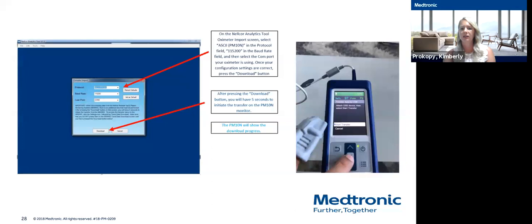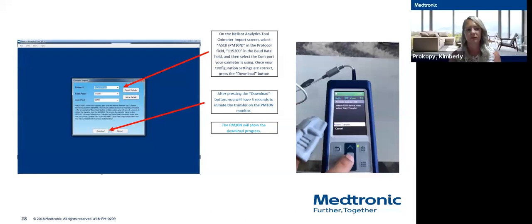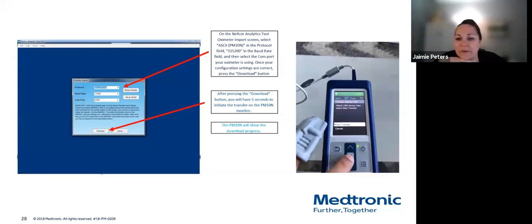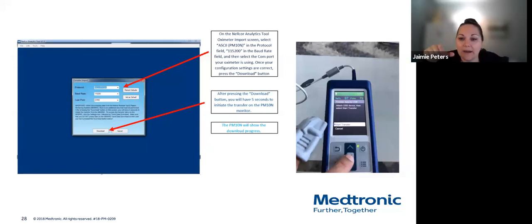Yeah, that's a good question. When we're doing that rest, we really just need to start recording when they start desaturating at the start. If we're wanting to do the 5-minute rest after to see how they improved, just doing a 20 to 30 second spot check is fine, especially with this machine because the data comes off second by second, and that would be like 20,000 pages of data. If you spot check every 10, 20 seconds, you can get a result of less than 1 page. So yes, I would use your spot check, Sheila.